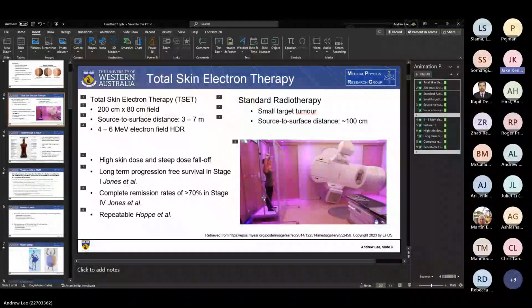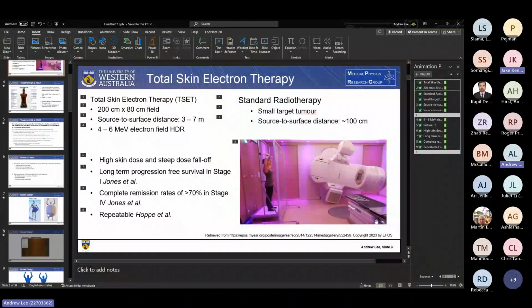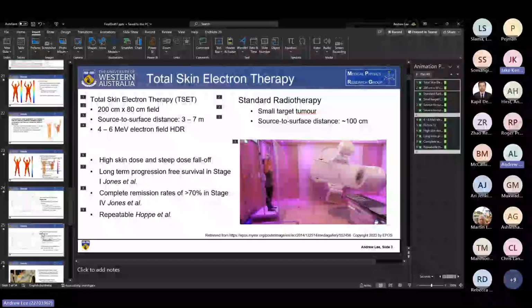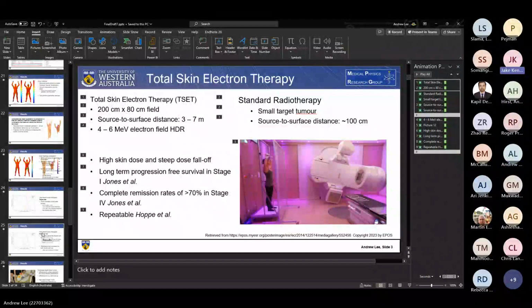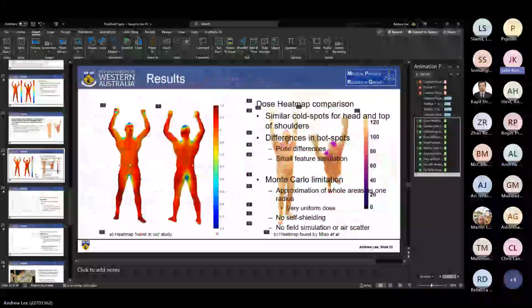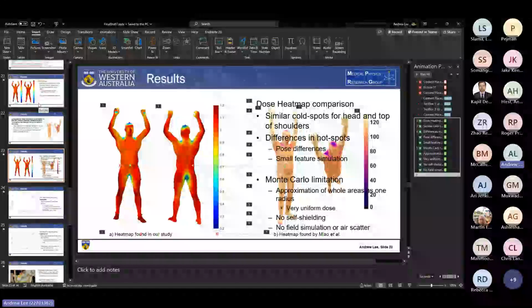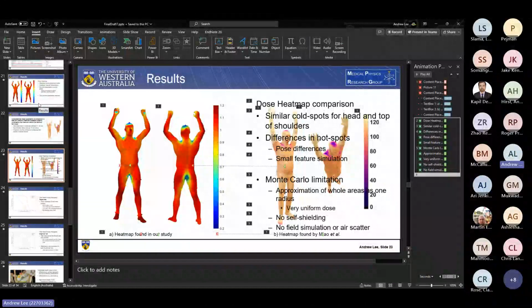Andrew, with the shielding considerations, I was just wondering if the shielding that would likely be implemented would reduce the dose to, for example, the eye, such that we wouldn't have any adverse effects on the eye? I mean, we did just hear Ari's presentation about the prevalence of cataracts even at really low doses. Yeah. So there's potentially going to be some cataract still.